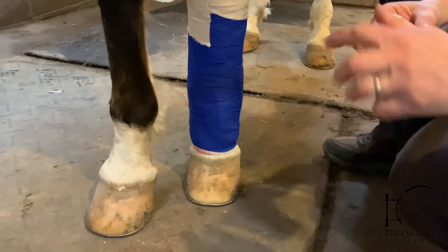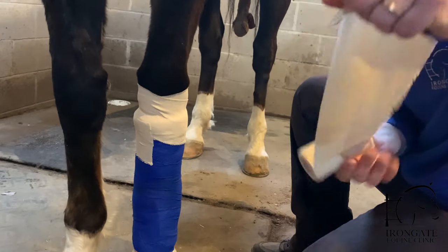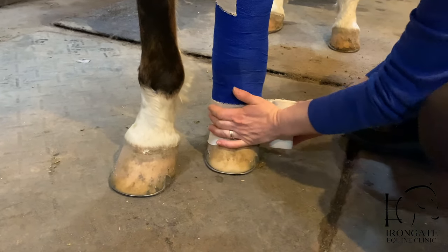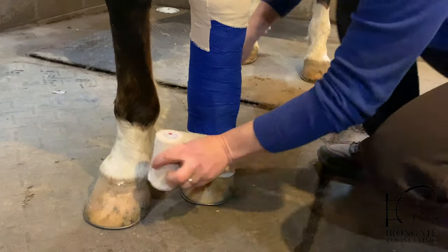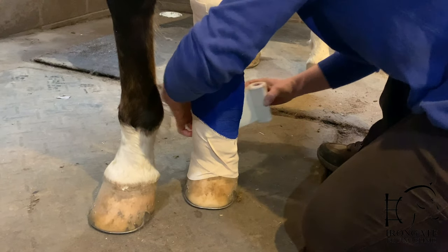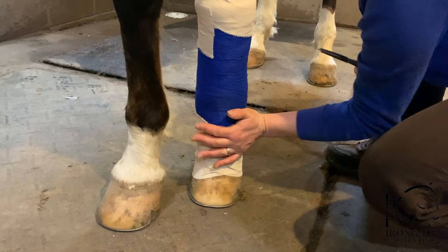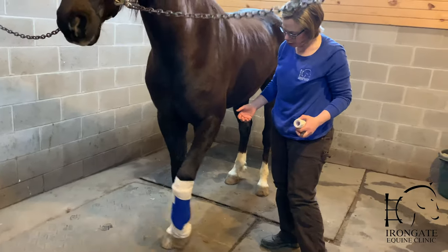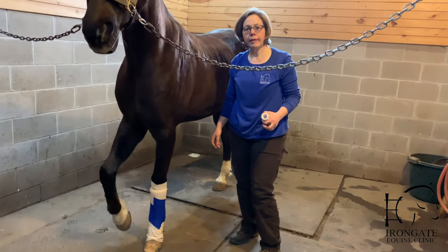Then we want to put another wrap like that on the bottom. If this stuff gets cold, it gets harder to work with. If your bandage goes low enough, you can tape it right to their foot to keep dirt from getting in the bottom, or from the bandage slipping down. So that's a lower limb bandage over a wound. A bandage like that, depending on your horse, should be able to stay in place for four to five days, depending on how wet the wound is. Thank you for your attention.